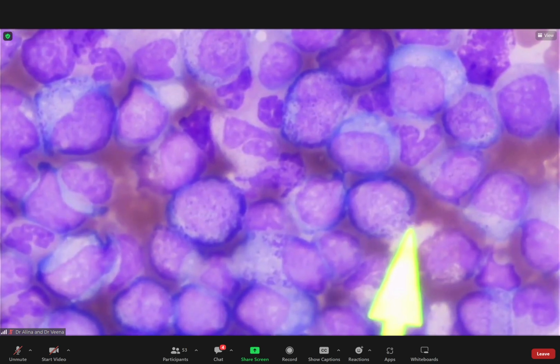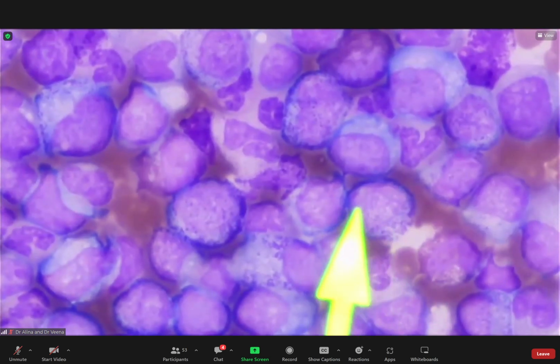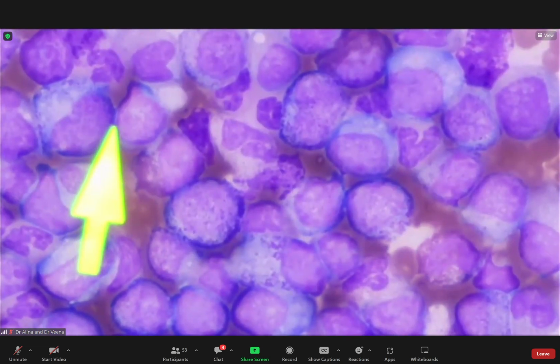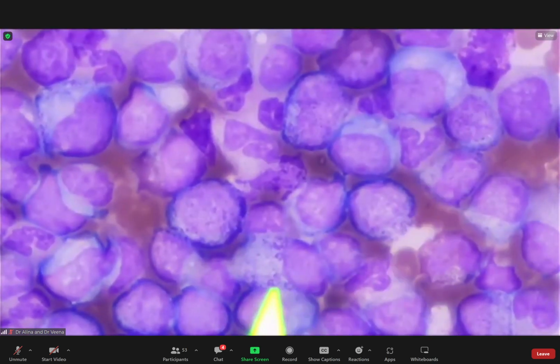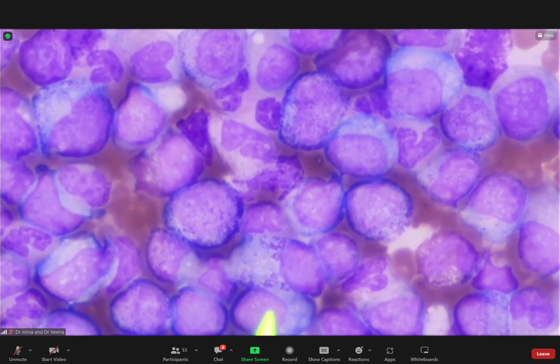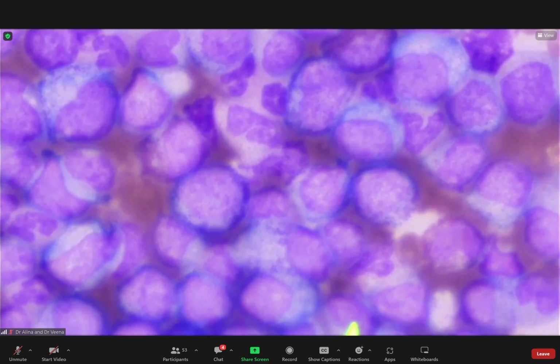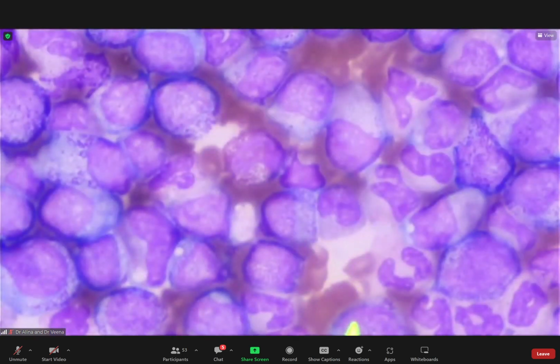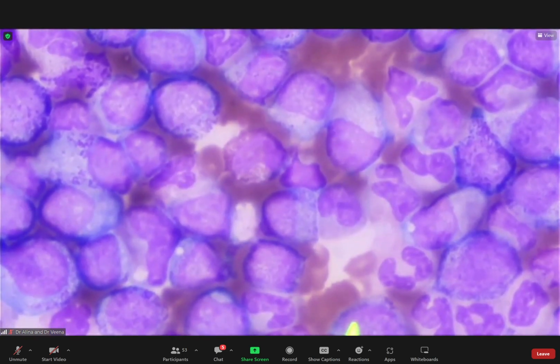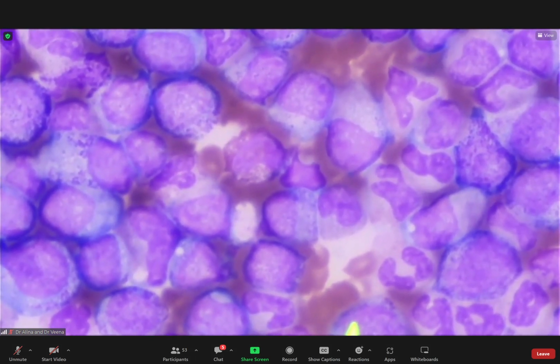If we look in the blood film closely, just in this field, there's quite a number of blasts. Yeah, that's a blast. Down here, this is a blast. Not so clear, okay, but I still give you marks if you said CML. I would give you 1 mark, but if anybody answered CML and AP, obviously got full marks.